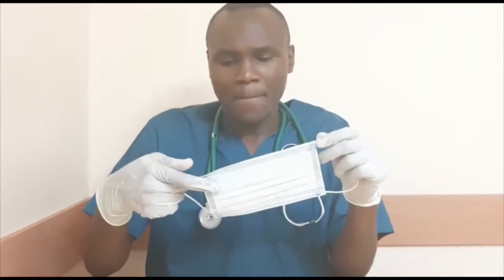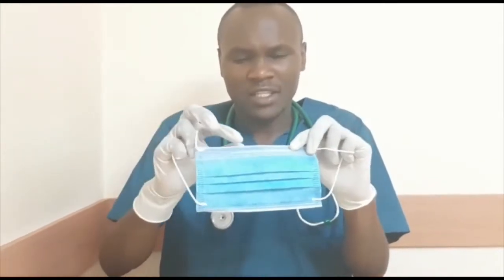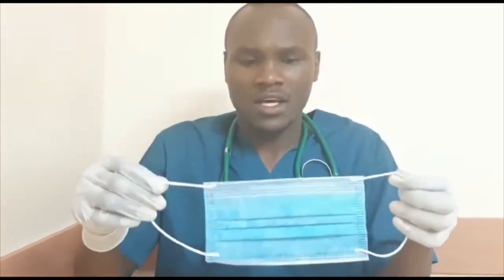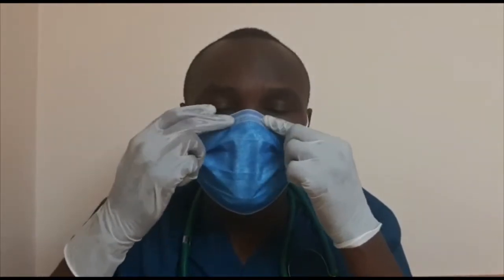Make sure the white part covers your face and the part with the metal strip goes upward to cover your nose. Make sure you do not touch the front or back of your mask. Pull the strap down around your chin, then take the metal strip and press it around your nose so there is no gap between your face and the mask.